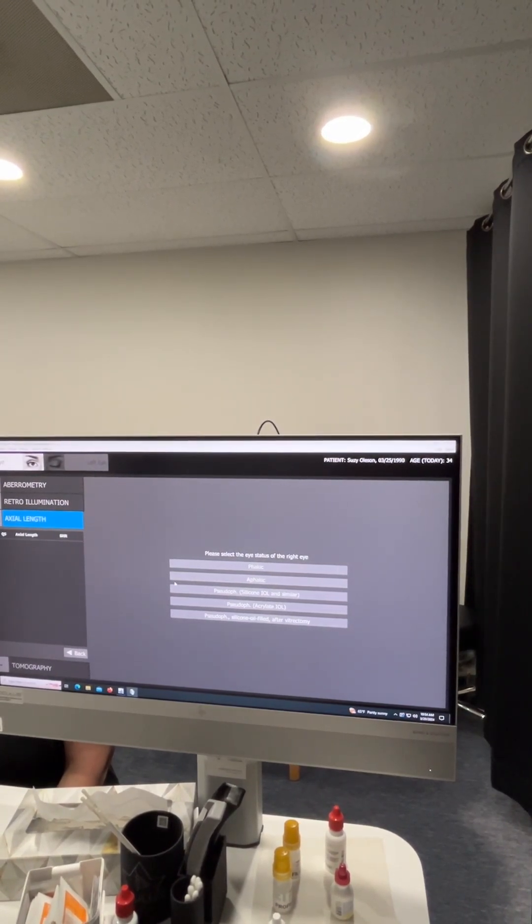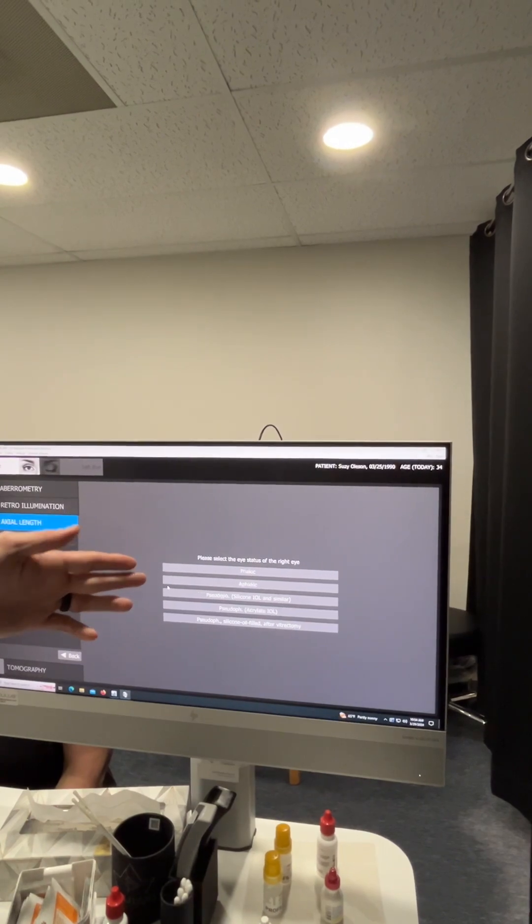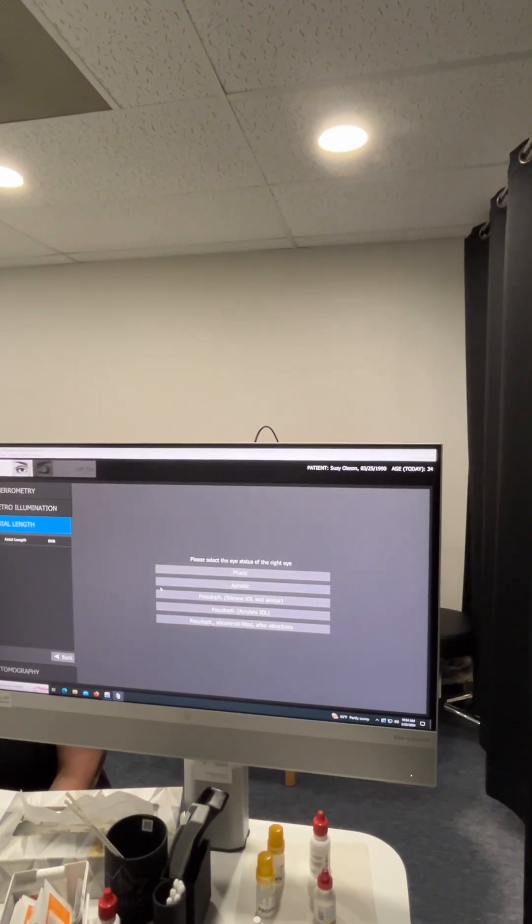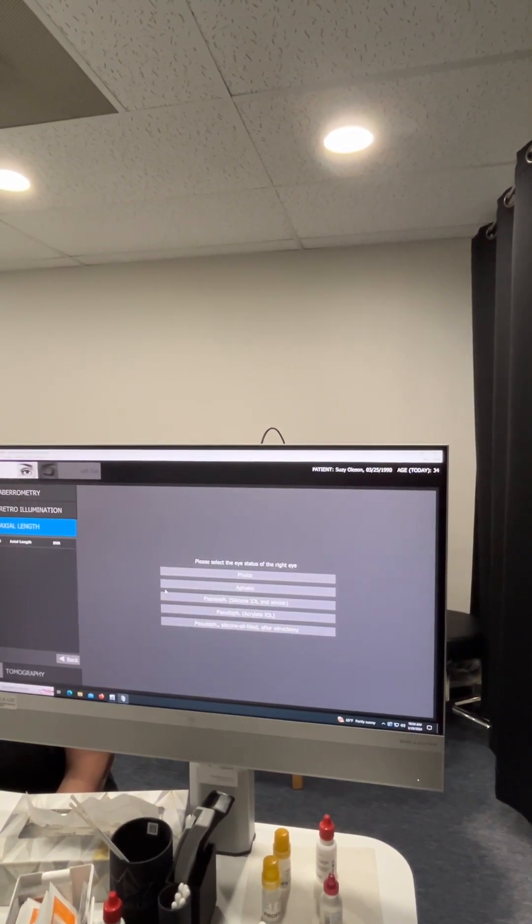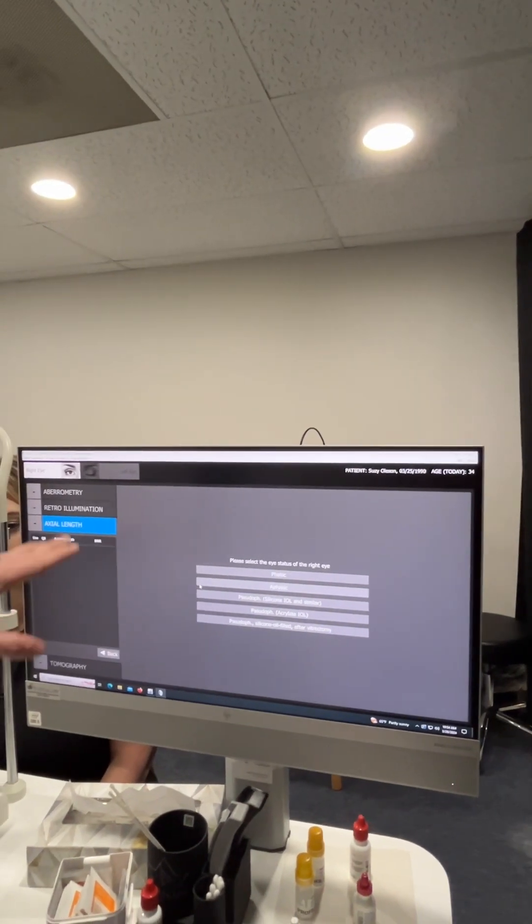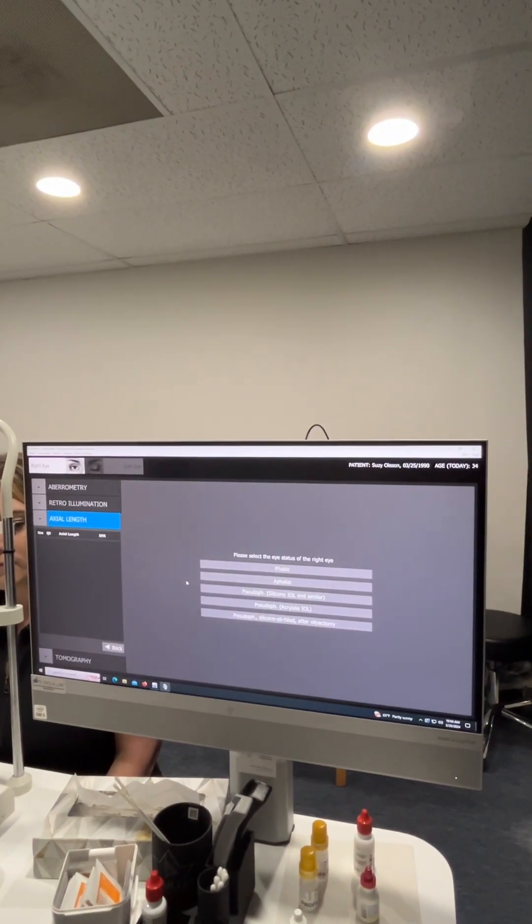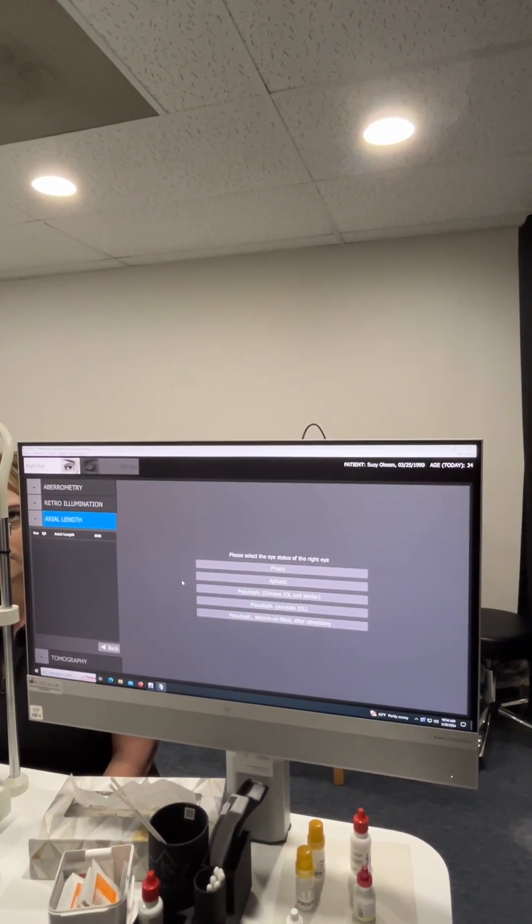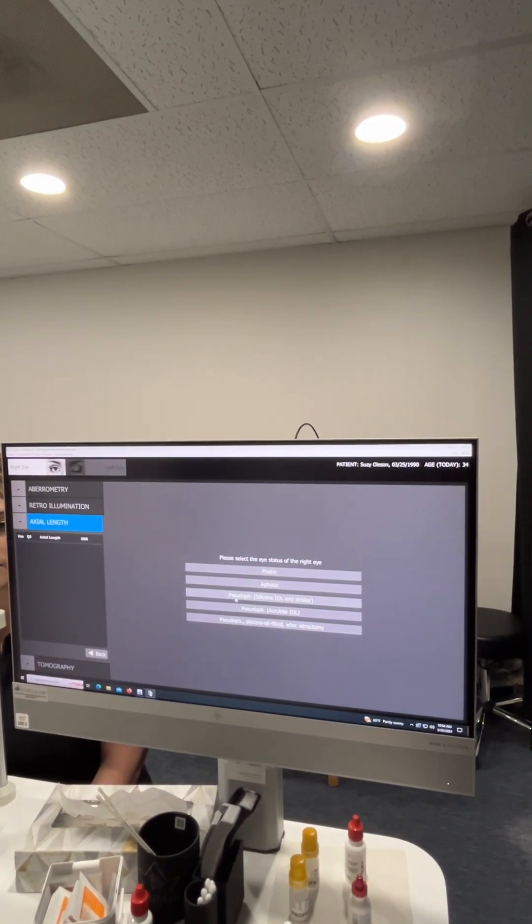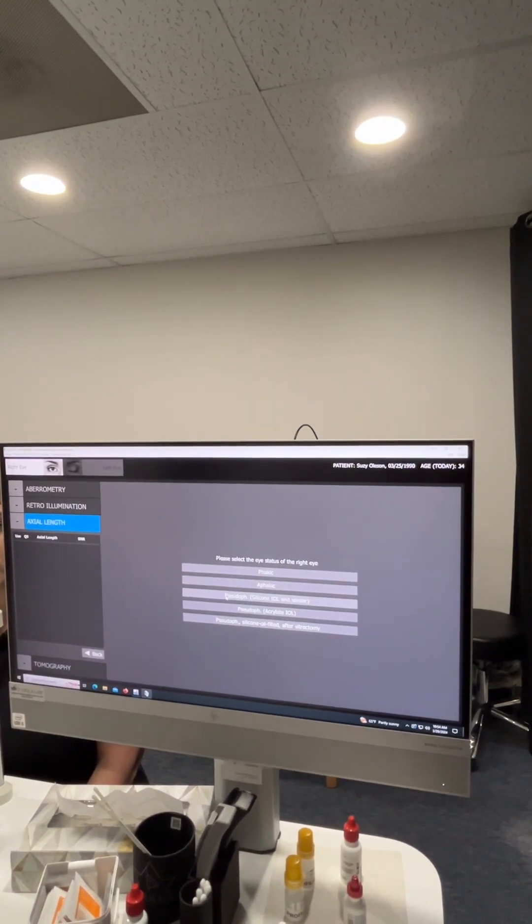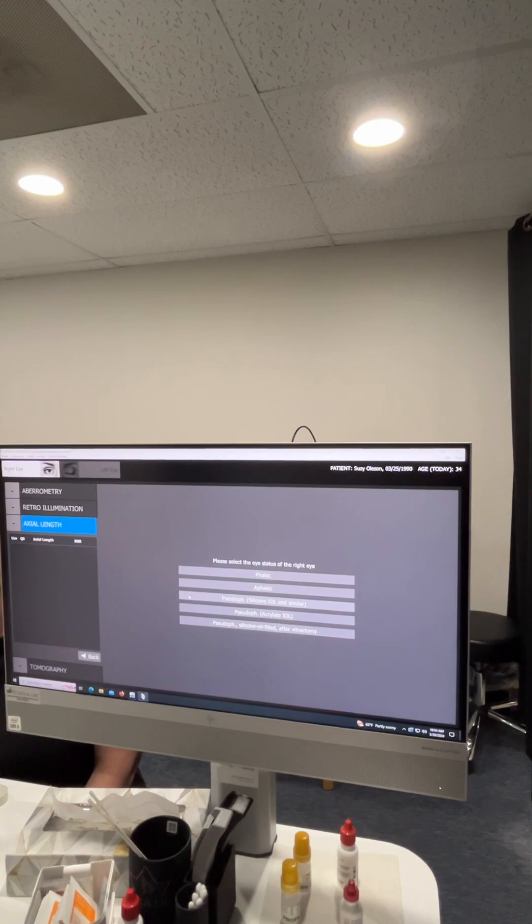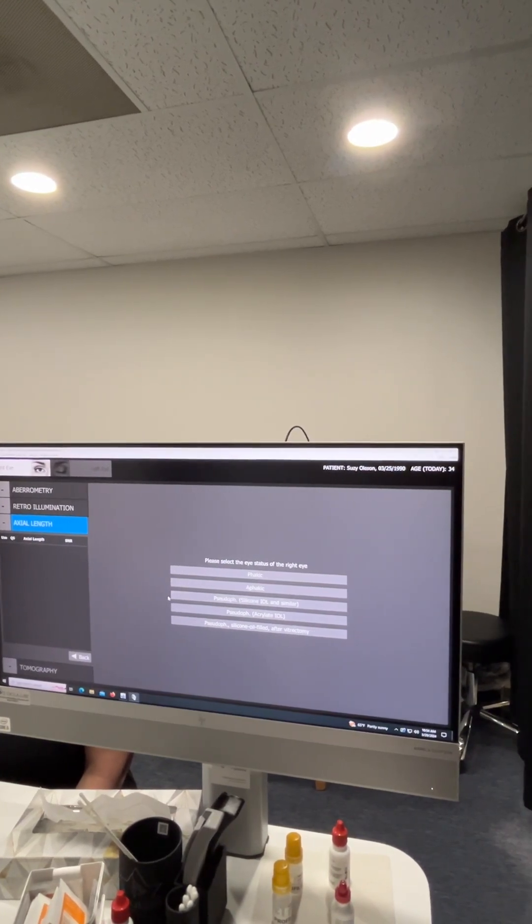You'll see that most people are going to be in the top one, Phacic. There's rarely aphacic patients, but they are out there and you do need to just confirm before taking these scans so that the instrument can calibrate appropriately. Pseudophakia is going to be our patients that have already had their cataract surgery with implants.